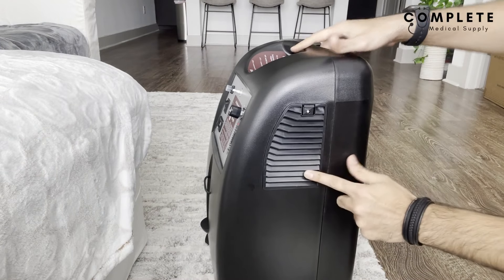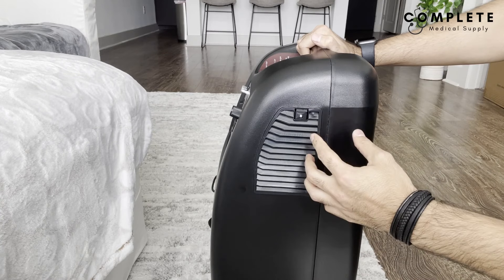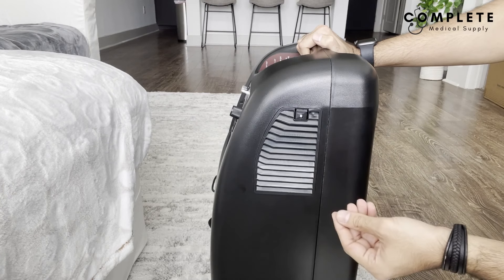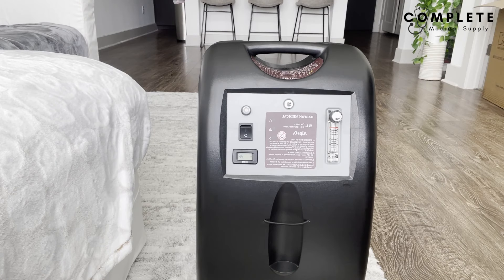All home concentrators should have a filter on the side or sometimes in the back of the machine. You can look at the filter to see if it's dirty or has any dust on it — they're usually hand washable with detergent. Make sure they're completely dry before putting it back in, because one of the main things the warranty does not cover is water damage.